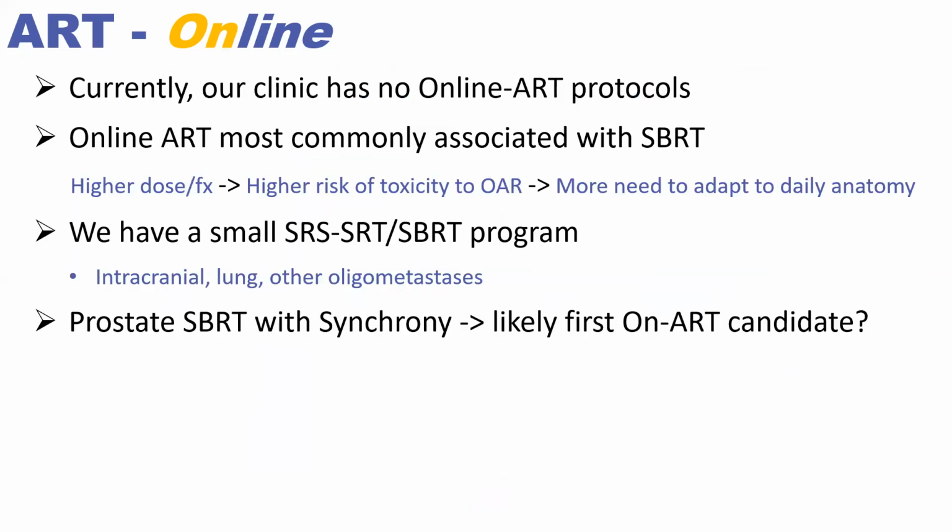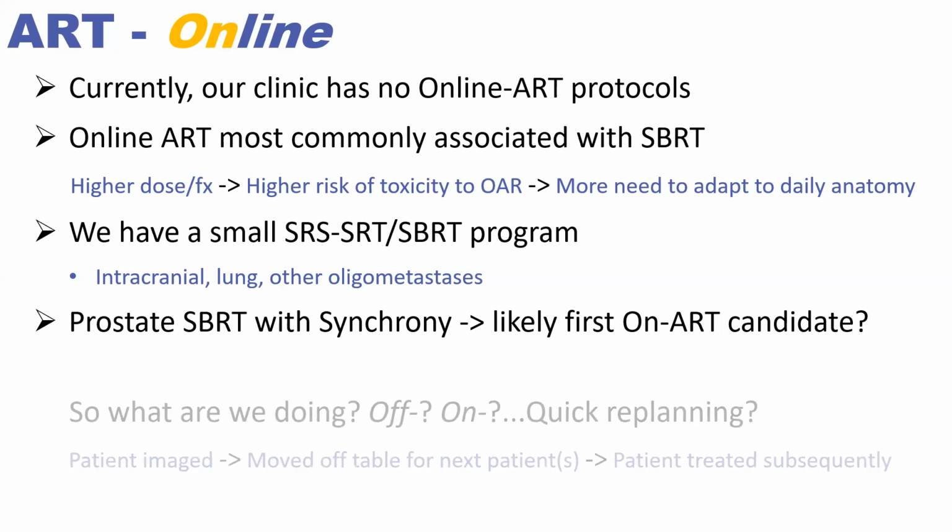So again, we have no online ART protocols in my clinic. It's obviously mostly associated with SBRT, like I said, due to the higher risk of giving higher toxicity to your organs at risk nearby. But we only have a small SBRT program, something we want to expand, especially with the technology we've gotten. Prostate SBRT with Synchrony is something I'm pushing. I really want us to begin it in our clinic, and my guess is that will be our first candidate for an online program as well. I think, as we're seeing, it's a perfect candidate.